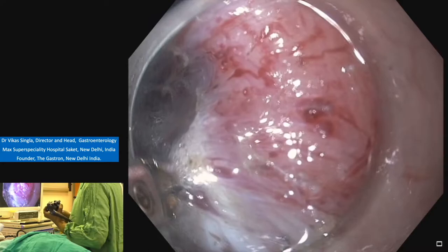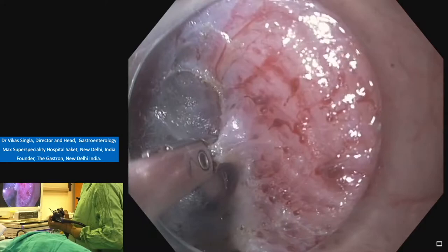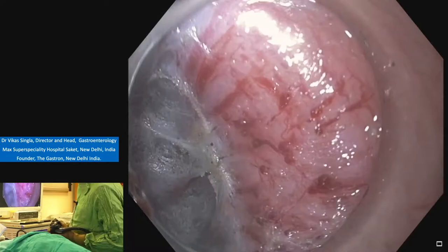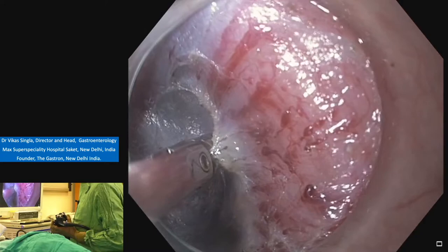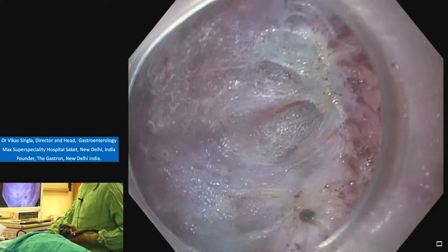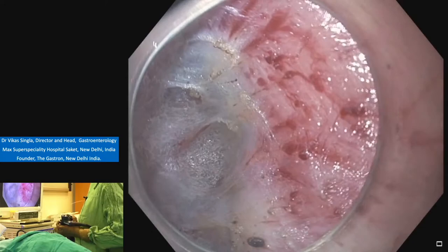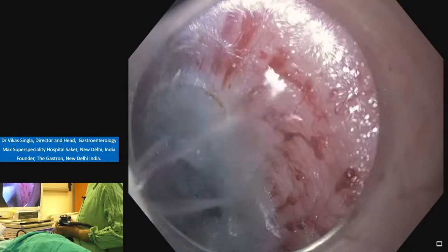Using the coagulation current again, post coagulation. More vessel there. Grab the vessel, pull the vessel, and then coagulate. Again, some vessel there. So pull them away from the mucosa and then coagulate. So stay close to the muscle layer. Get more fluid, more injection there.